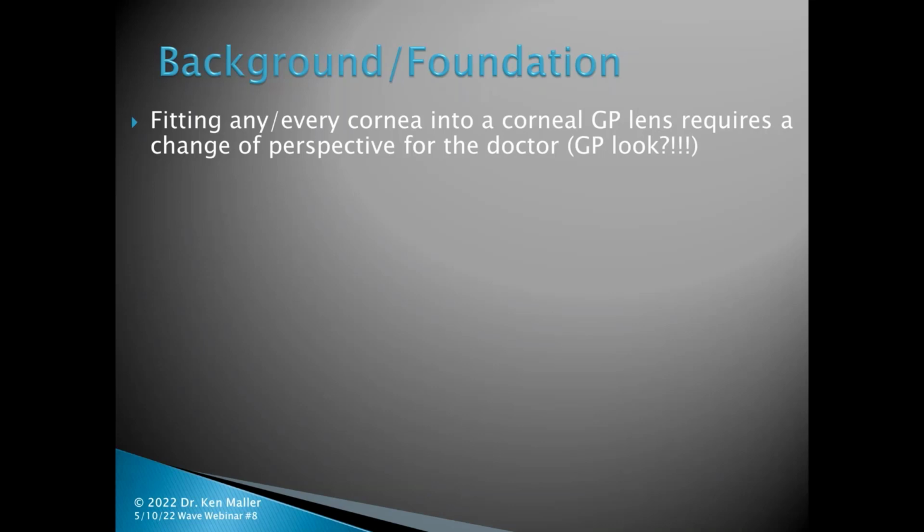And I really had to correct him and say, that's not a GP look. That's the look of a patient who has a lens that doesn't fit well on the eye. That has nothing to do with GP lenses. If GP lenses are fit properly, they do not have that look. So it really does require a change of perspective, because if you're going into it thinking that that's normal, that's already sabotaging your efforts at getting a successful lens on this patient.